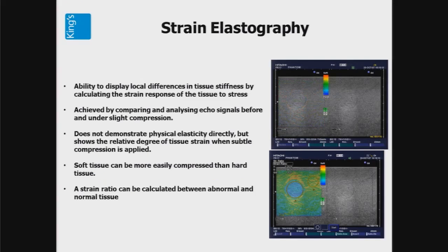You will be familiar with strain elastography in your other clinical practice, in thyroid disease, for instance, where you're using pressure and movement to cause displacement of the tissue, and you're looking at the response of the tissue to that displacement and labeling it as either hard or soft. In this machine, which is the real-time elastography from Hitachi, hard is labeled in blue. Other machines label hard in red. So there's no standard out there with the companies at the moment.